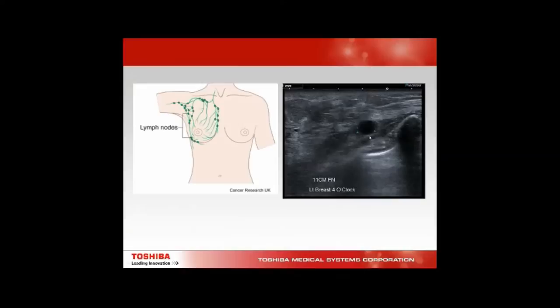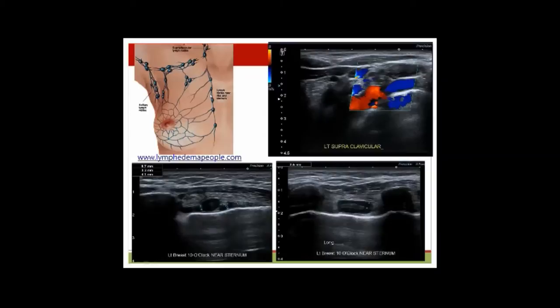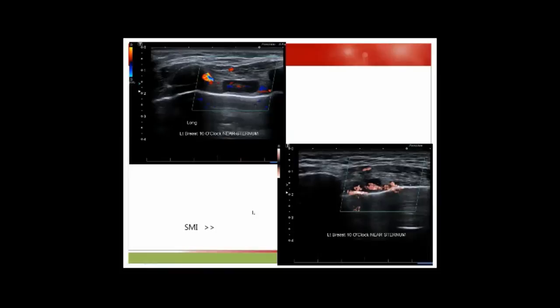In some patients this may be the first or sentinel node, so it's important to go down the side of the breast. Don't forget the internal sternal nodes, which can be covered when scanning in longitudinal from the sternum in as you do quadrants on the inner half. This lady had abnormal sternal nodes — we can see these abnormal nodes with the costal cartilage in view.